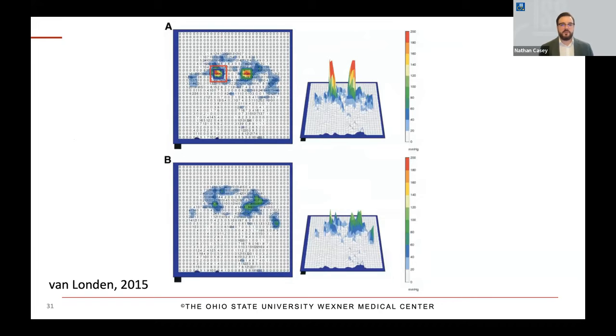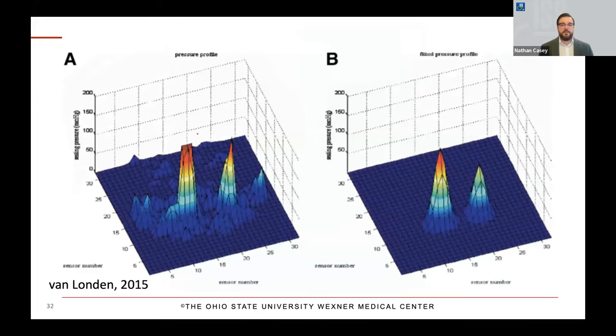Obviously, nobody wants to go around all day with stim on their glutes, and that poses its own inherent risks to skin and tissue health. But I think the important thing to consider here is the fact that even with one session of electrical stimulation, we can modulate that tissue, and then we can cause changes at the physiologic level. So it doesn't have a direct correlation necessarily to prolonged seated outcomes, but it shows promise that maybe it could be part of a maintenance program to help with somebody improving their overall seated pressure throughout the day.